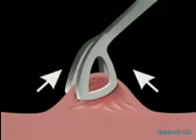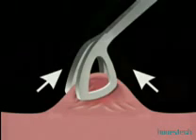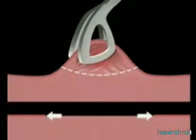The curved beam is designed for the resection and dissection of lesions involving the free edge of the vocal fold, concave towards the right for the left vocal fold and concave towards the left for the right vocal fold. The curved beam avoids injuring the vocal ligament as the operator maintains the free edge of the vocal fold taut with microforceps in order to be as far away as possible from the vocal ligament lesion. The exerted traction stretches Reinke's space and the epithelium surrounding the lesion.